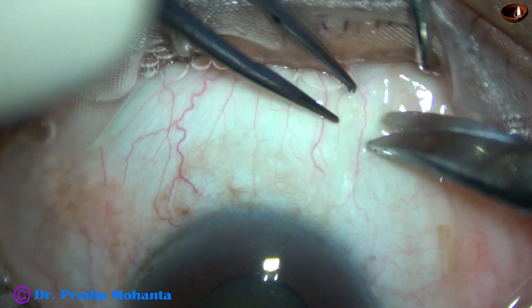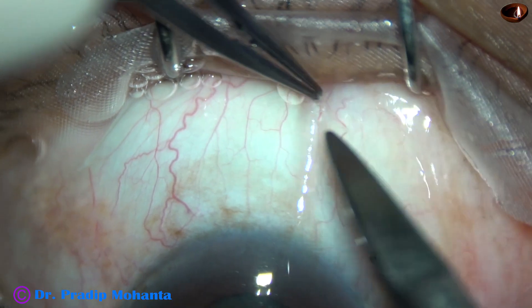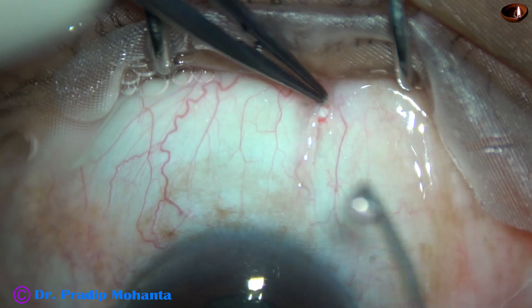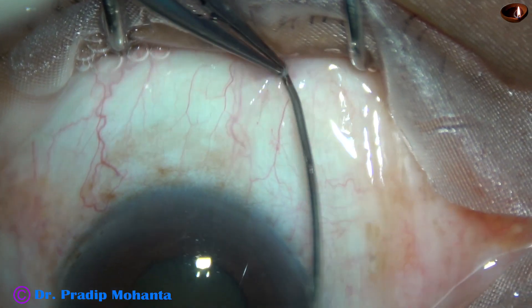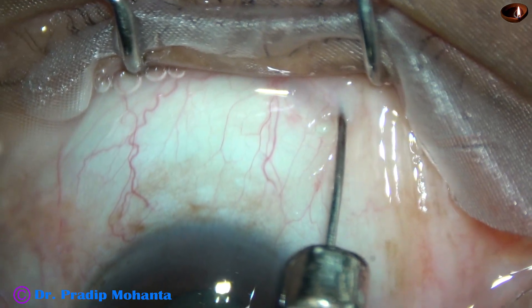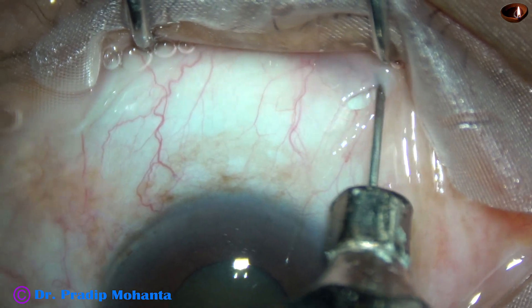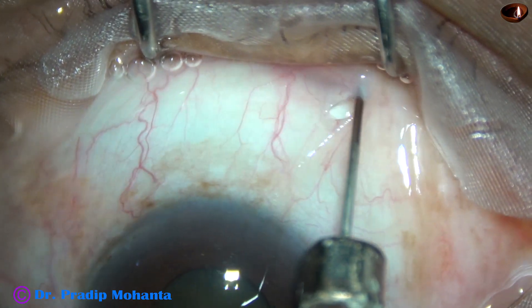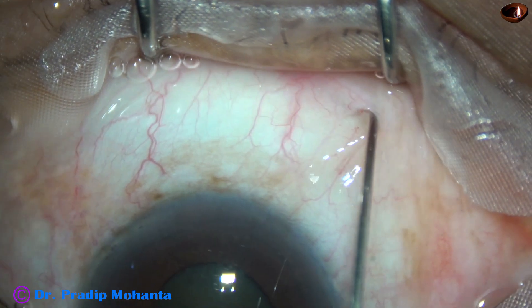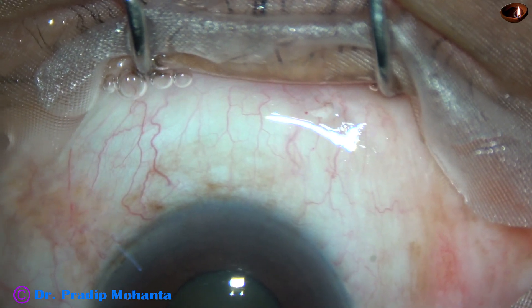Friends, this is the sub-Tenon's block. A small nick in the conjunctiva, the scleral surface is exposed, and then lignocaine with adrenalin is injected. In the posterior aspect of the sub-Tenon's space, about 2 cc of lignocaine is injected. This patient has a hard cataract with small pupil and the patient is under topical anesthesia, so I thought of using this sub-Tenon's block.